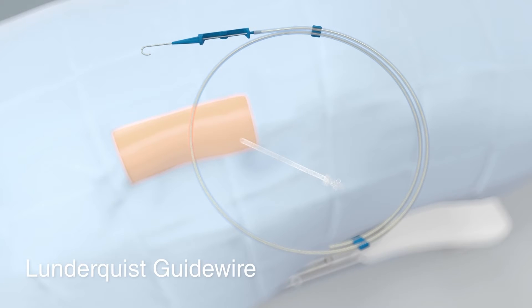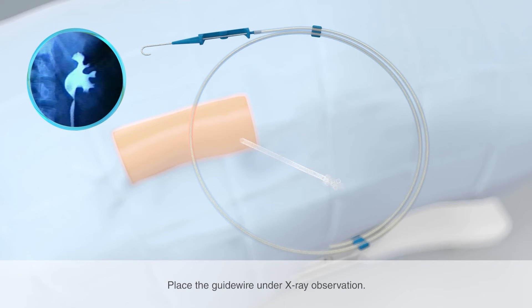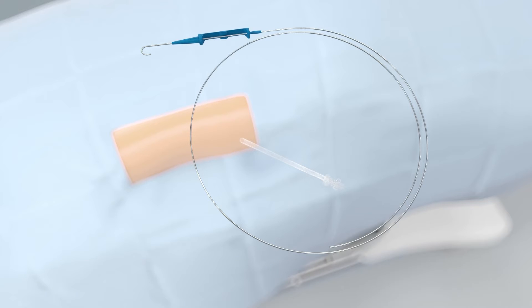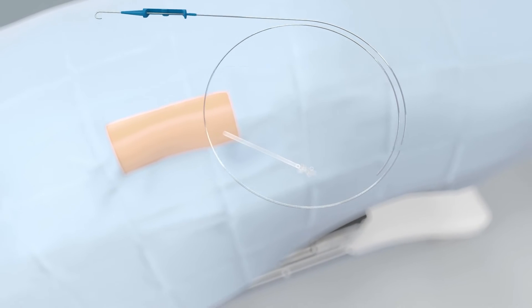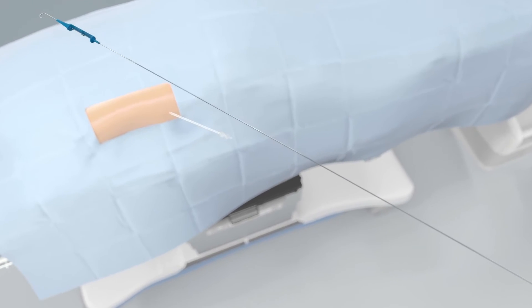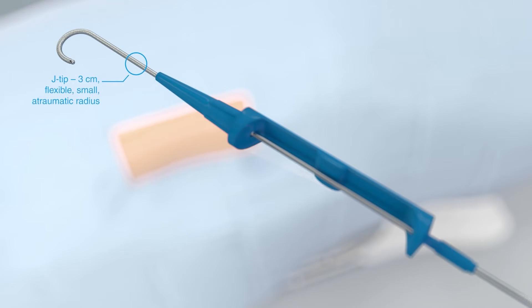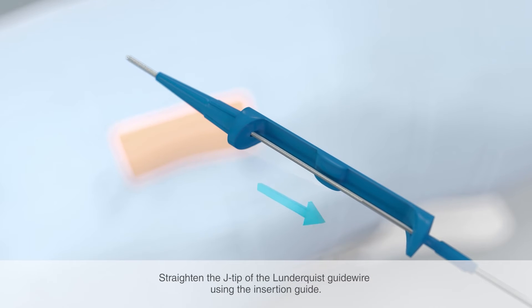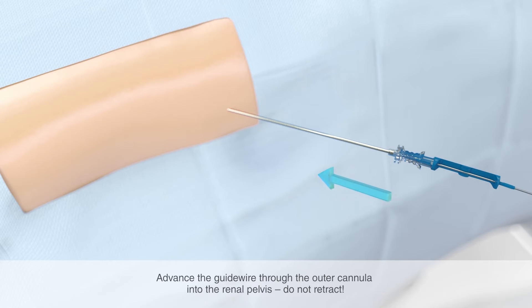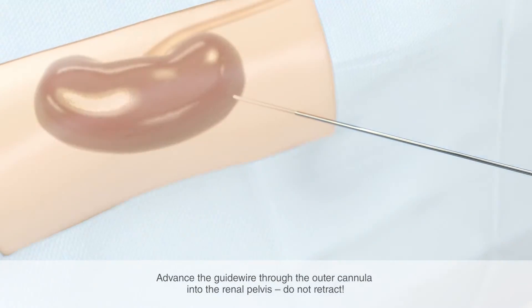The Lundqvist guide wire serves as a flexible guiding instrument for the balloon catheter and the fascial dilator. Application of the wire should be carried out under constant x-ray observation for position control. Remove the protective tube from the Lundqvist guide wire. The Lundqvist guide wire has a diameter of 0.035 inches and is 90 cm long. The J-tip, only 3 cm long, is flexible and has a small atraumatic radius. Straighten the J-shaped tip using the insertion guide — the tip must be fully retracted. Now attach the guide wire to the Luer-lock adapter of the puncture cannula and advance the Lundqvist guide wire through the outer cannula into the renal pelvis. Do not retract the wire.